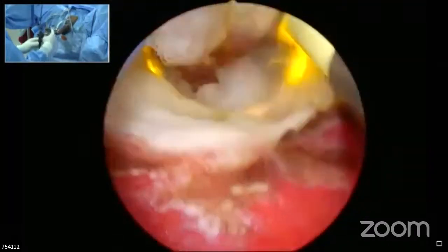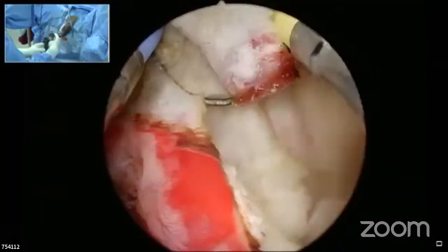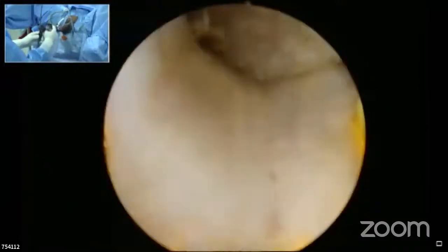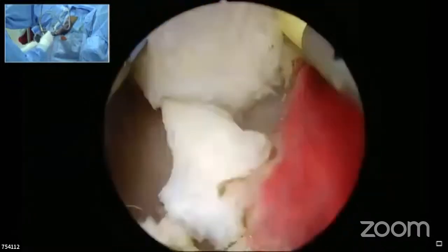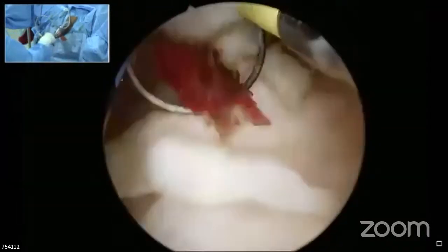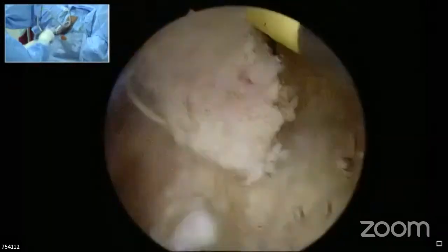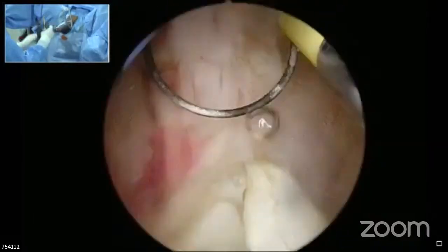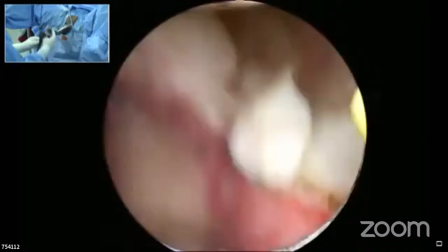The point which I wanted to emphasize in the TURP resection is his ability to reorient every time. After some resection, he comes back, sees the sphincter area and reorients by rotation, not by moving the scope inside and out, which is to be avoided. As far as possible, reorientation should happen by rotation, which is much less traumatic to the urethra than an inside-out movement of the resector scope. What do you say on that, sir?